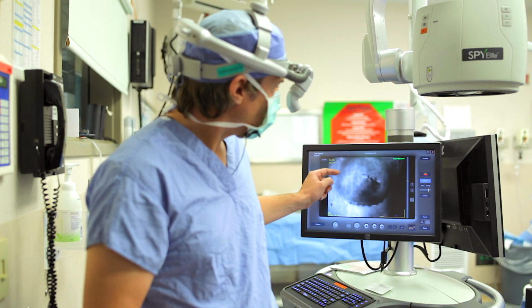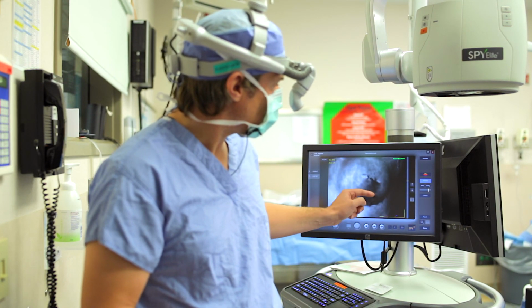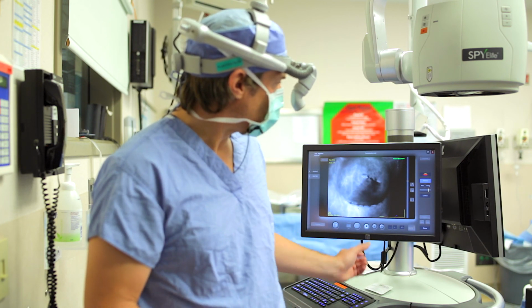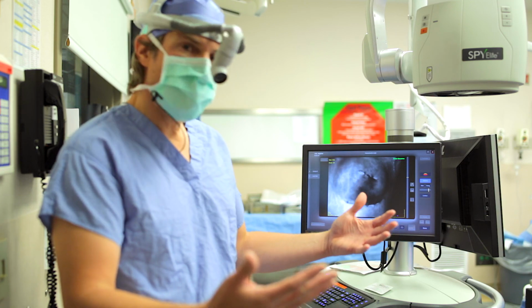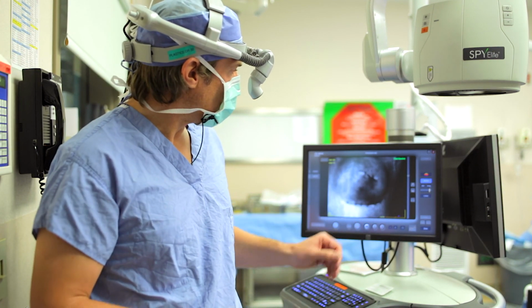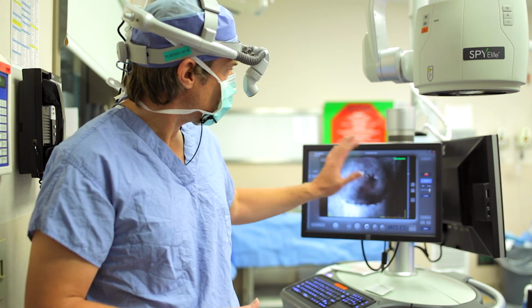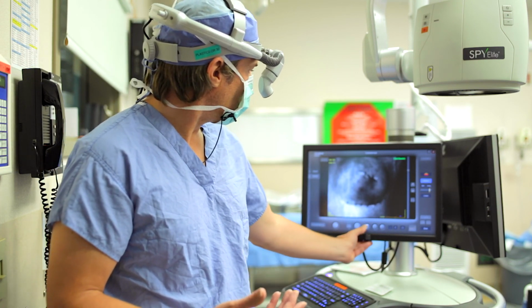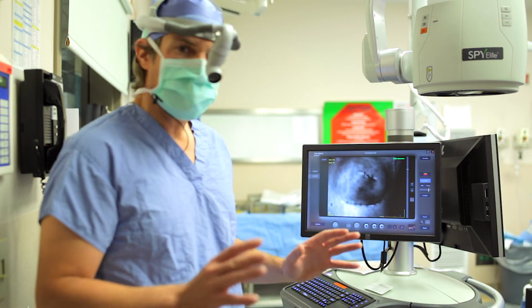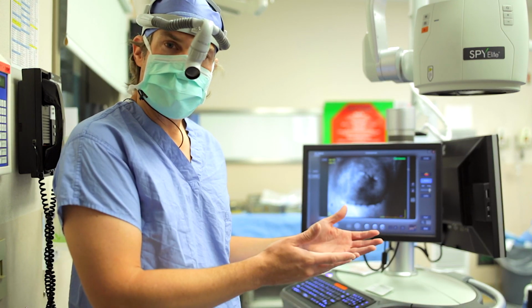You can see the comparison of the tissue here versus the tissue here. This does not look as well perfused. The question is now what do we do with this information? Because I have an adjustable implant, and you can get the sense that there's some contour there, I'm going to make an intervention. I'm going to say, you know what? This is not ideally perfused. I'm going to take volume off.